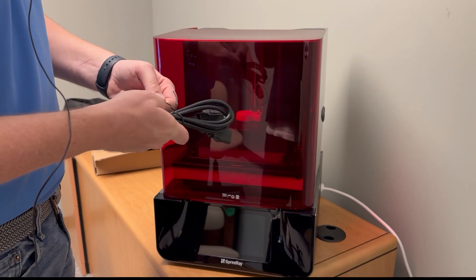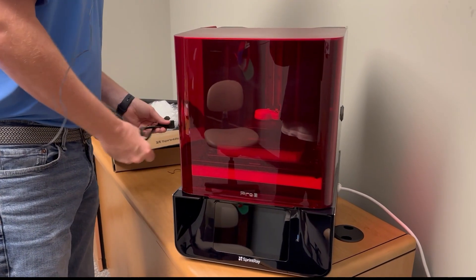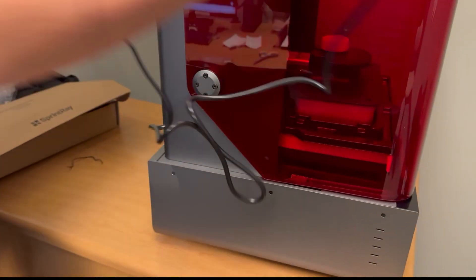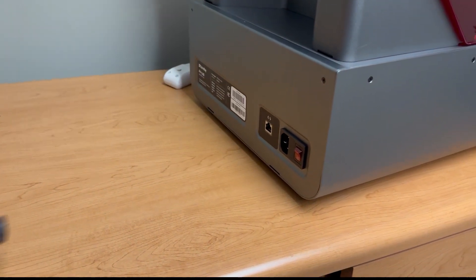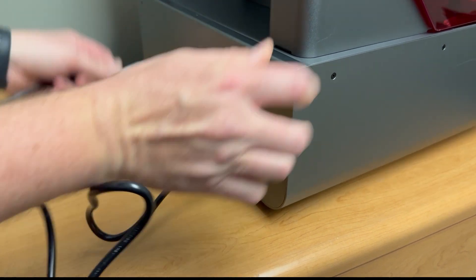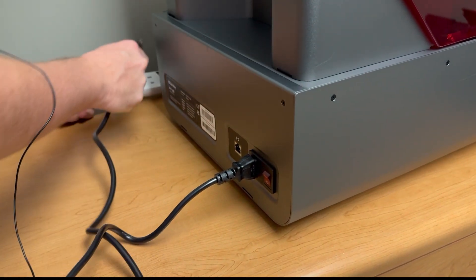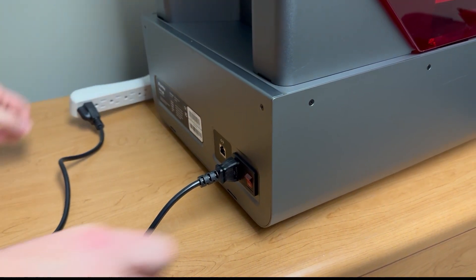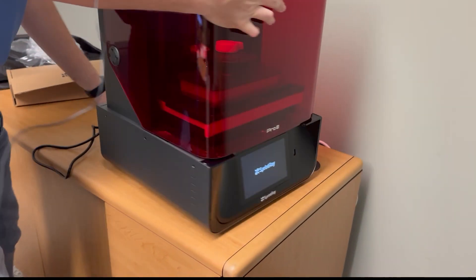Once you set up, it has a very small footprint. Let's look at the back — you've got a place for the power cord right here. We're going to put that in, then let's plug it in. A light came on. Let's go back to the front and see what it did to the front of our printer.